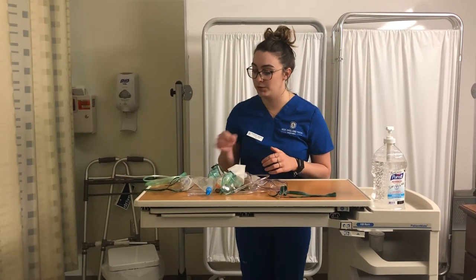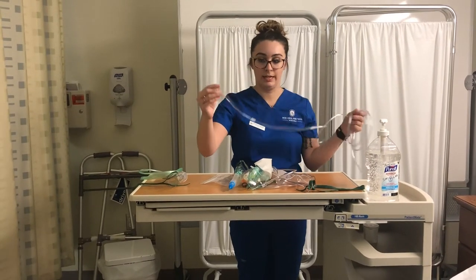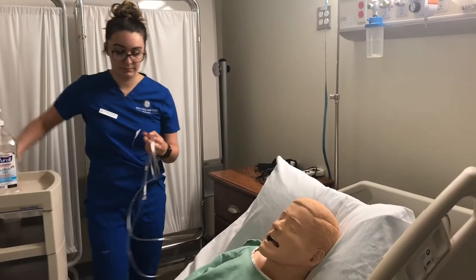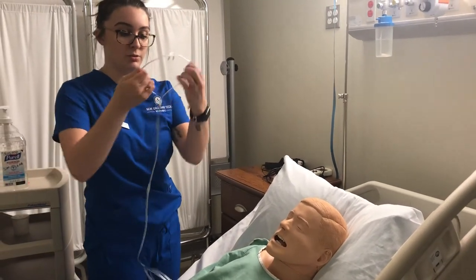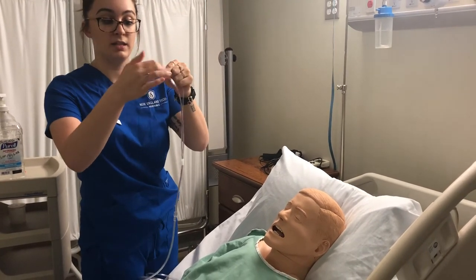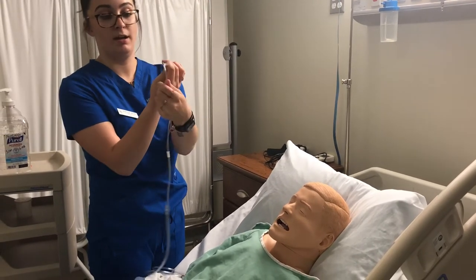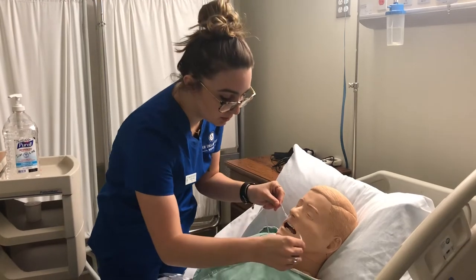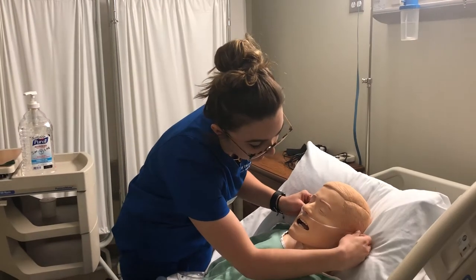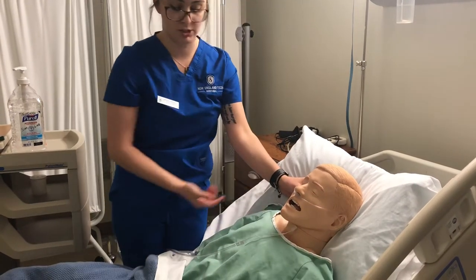We will first start off with a nasal cannula. This is what a nasal cannula looks like. You put it on the patient like this, making sure the strap is down so you don't choke the patient, and that the tubes are at an upward angle — not upside down. You put the tubes in the patient's nose and place the tubing behind the ears.